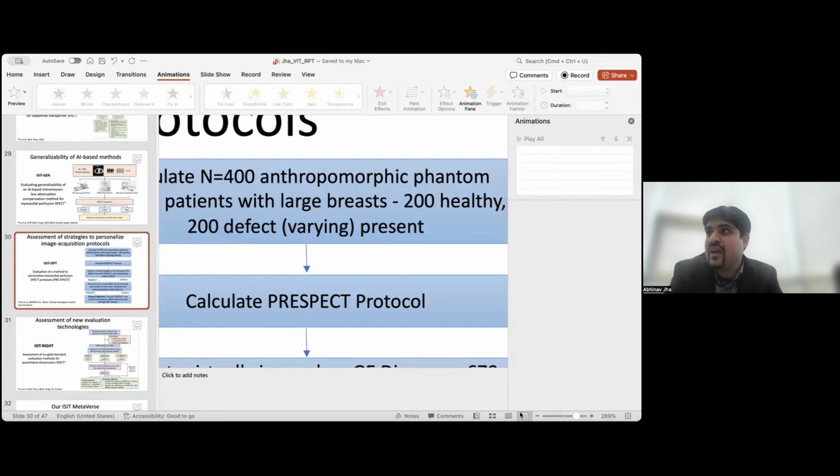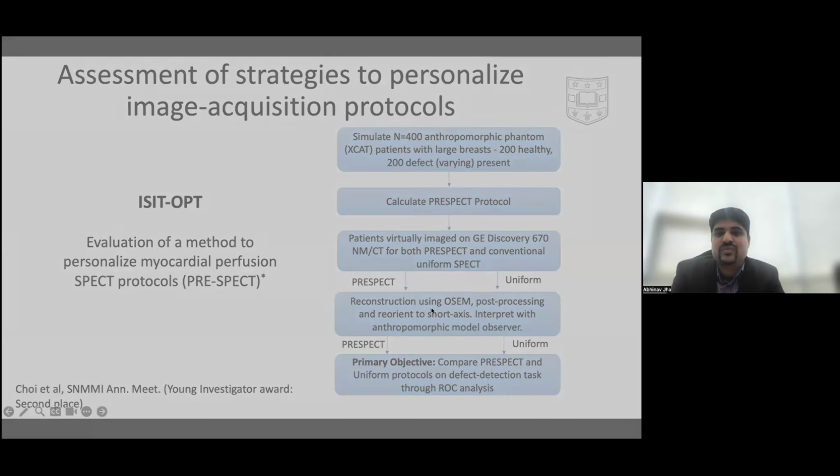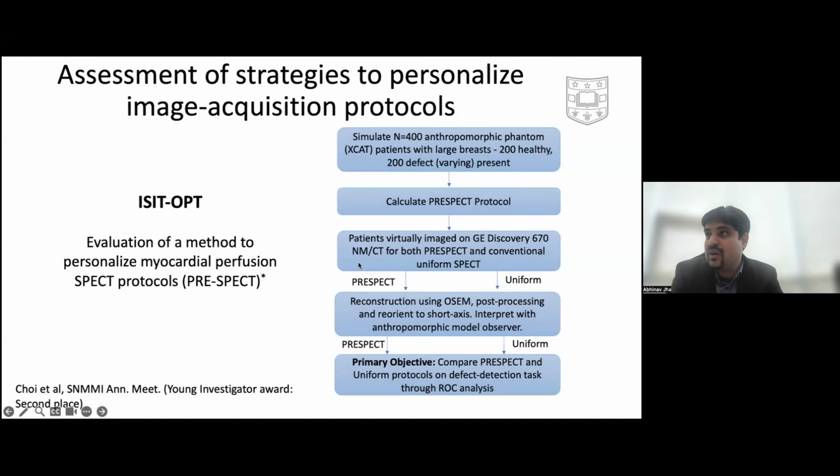Are you giving weight to the scatter from the patient? In this case, we actually had scatter data. We did not do scatter correction. We did attenuation correction from what I recall. It was cardiac SPECT, and we were trying to emulate the clinic, where we were seeing mostly attenuation correction being performed. But scatter correction is certainly an important thing which needs to be accounted for. Can you tell me the motivation behind your question?